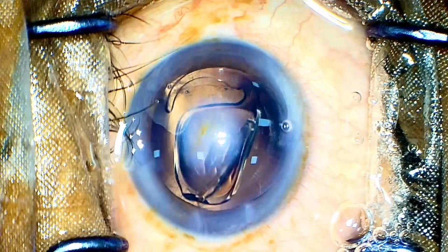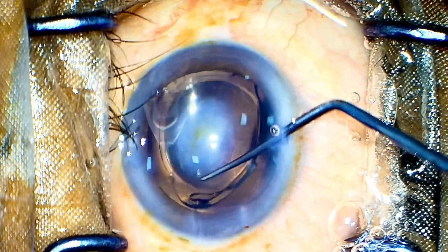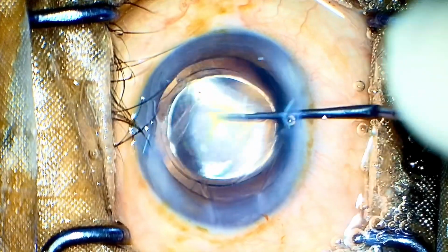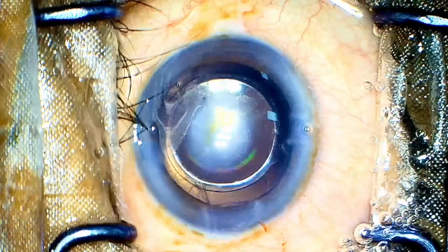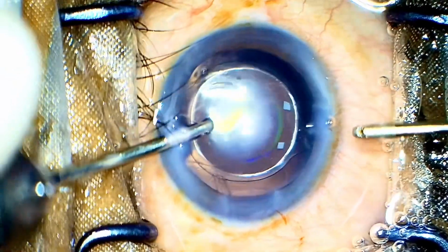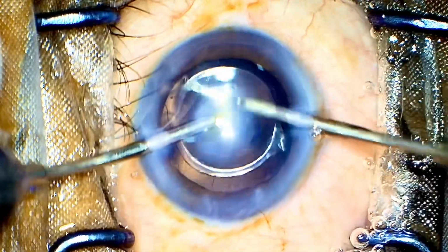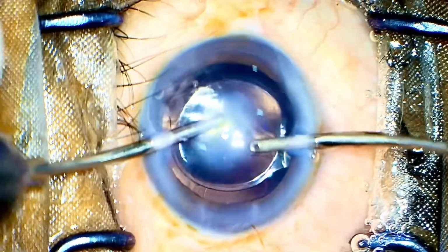So yes, it's a monofocal lens. It's an aspheric, 360 degree square edge IOL, which gives these patients brilliant results at no cost to the patient. These patients hail from underprivileged backgrounds, and I'm just a tool in the hands of God and feel really blessed to help these patients out. Minimal cortex has been left, and I'll be aspirating it with my irrigation aspiration. I strategically took this step of implanting the IOL first and then going with the cortex removal because of the visibility in the center.